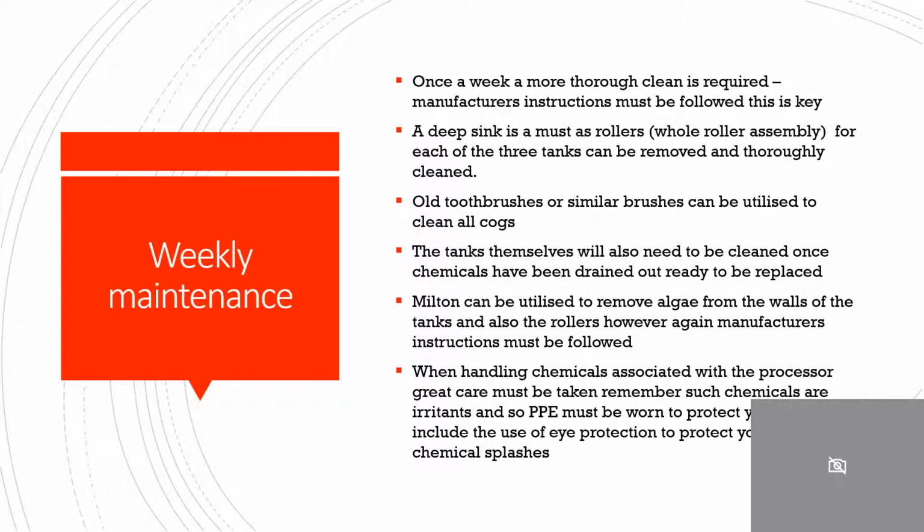In relation to this type of processor, again, this equipment isn't relevant to digital X-ray. However, again, it may be that you encounter such a piece of equipment working at another branch, or if you move practices, and you will see the difference in the care required with what is now classed as an old-fashioned means of X-ray taking or X-ray developing. A lot of practices have moved now towards digital, but it is still important for you to have this awareness.